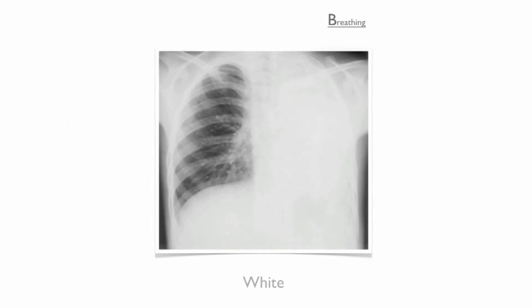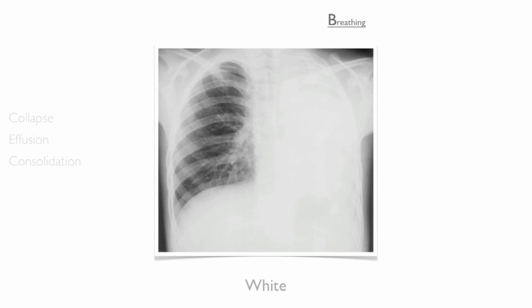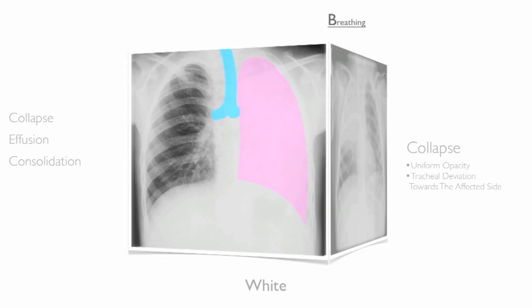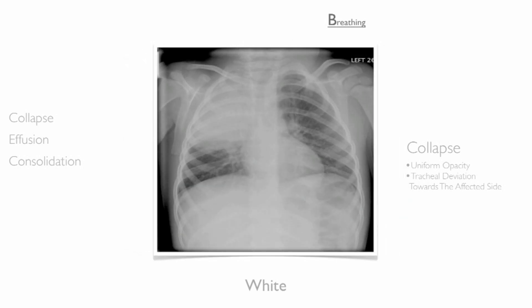Let's now take a look at the white lung. Common causes of the white lung include collapse, effusion and consolidation. Collapse presents with uniform opacity and tracheal deviation towards the affected side. Note, however, that tracheal deviation does not always occur. In this image showing right upper lobe collapse, there is no tracheal deviation.